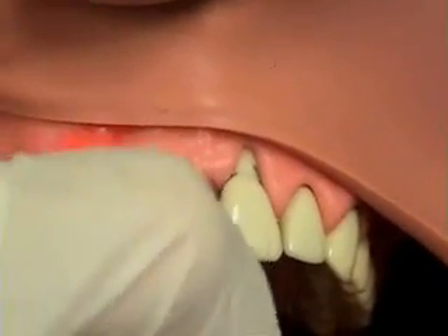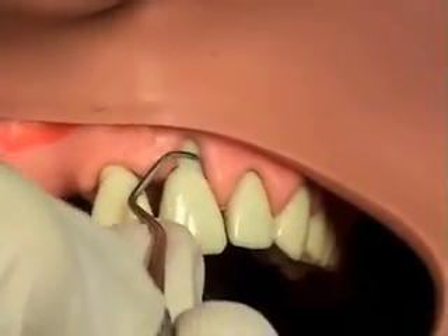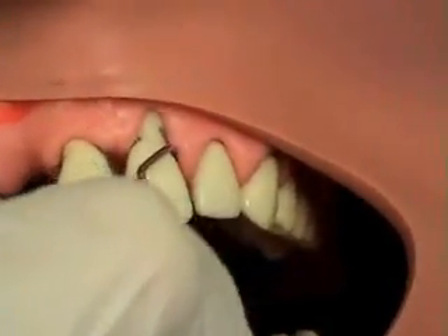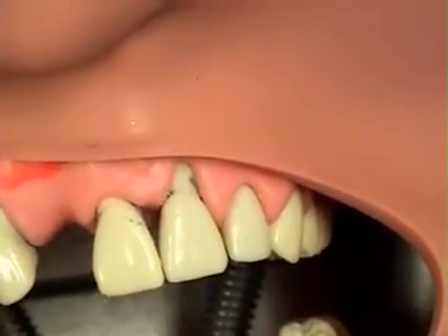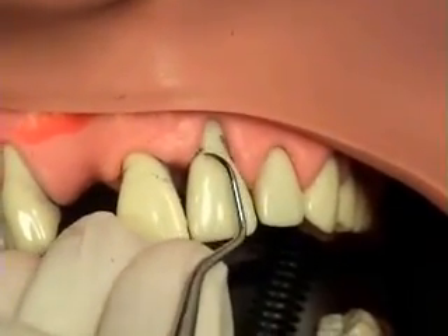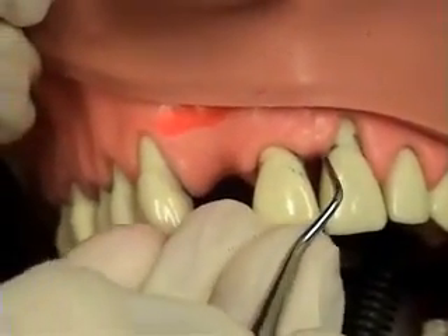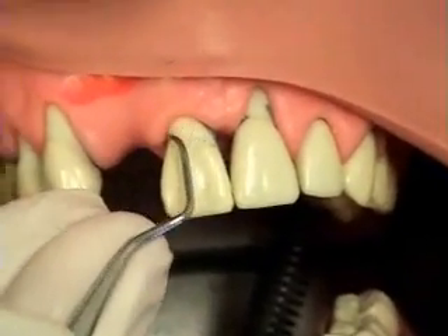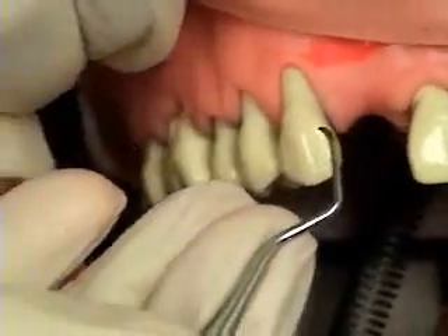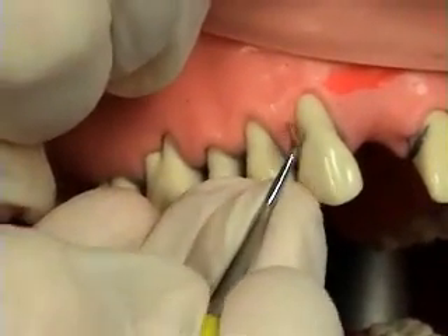The clinician makes access easier by asking the patient to turn right, left, tip chin up or down. For surfaces towards on the anterior teeth, she has flipped the instrument to the opposite working end where the surface is facing back toward the clinician. With the universal in the anterior, to complete both surfaces of the tooth you must flip to the opposite working end. In the posterior, it's the same working end to complete the posterior tooth, but with opposite cutting edges on the same end.